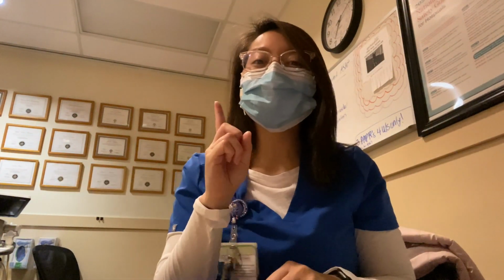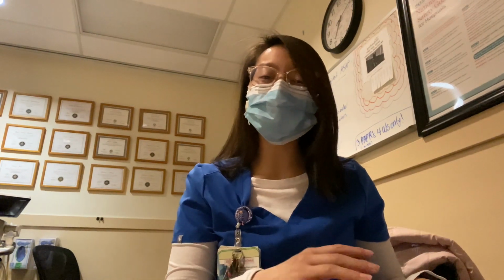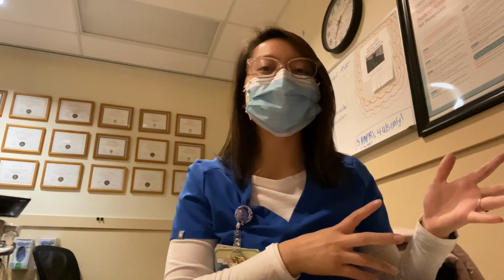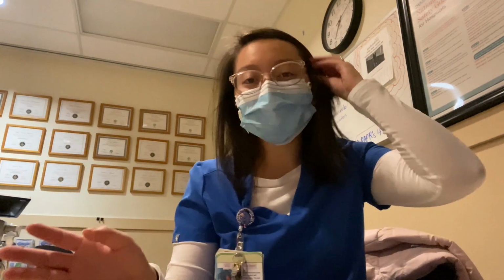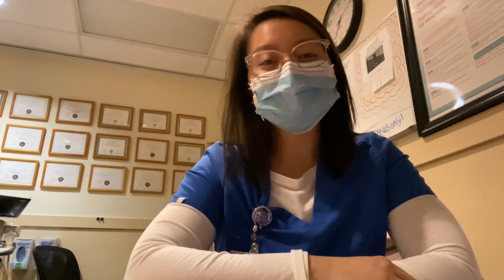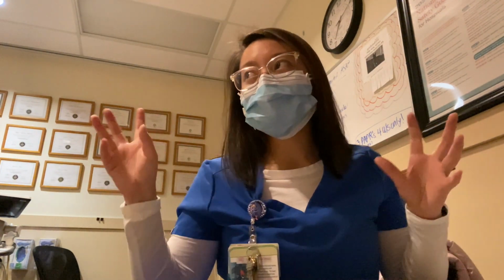All right, you guys, first thing we do as workflow is check the schedule. Schedule should already be made from the night shift. See if it correlates with the schedule on the PACS system. And then I check how many procedures there are. Usually the workflow is in charge of the procedures and getting them done. And then I'm also going to assign the people that come in to do some patients. And usually we'll send someone to certain towers.